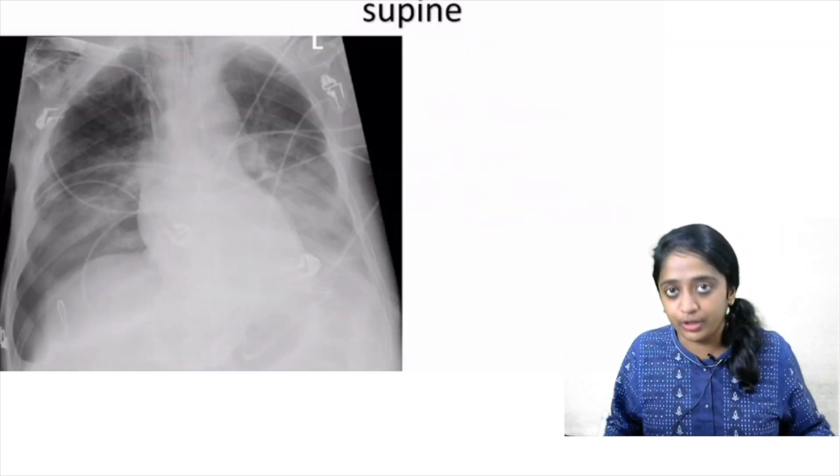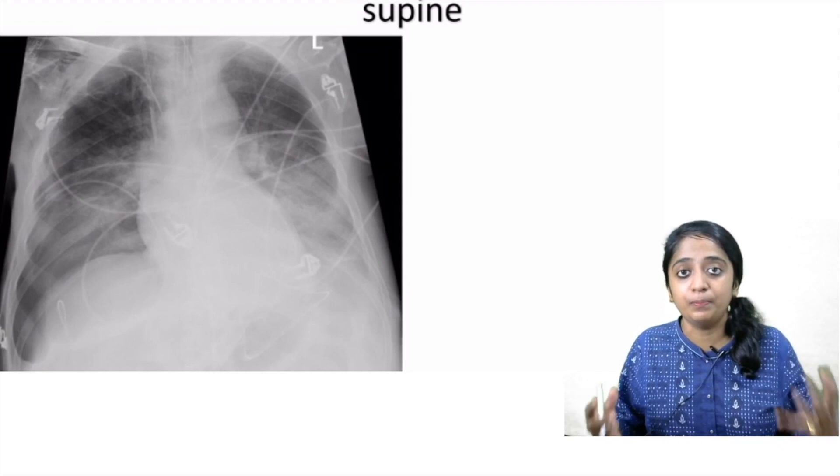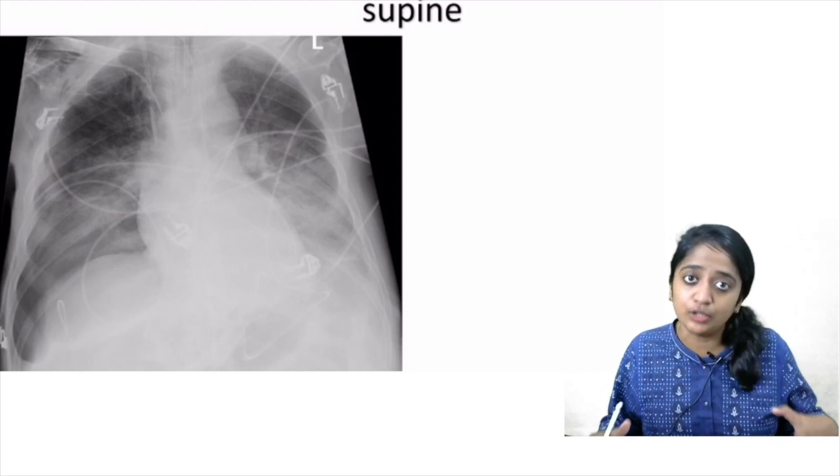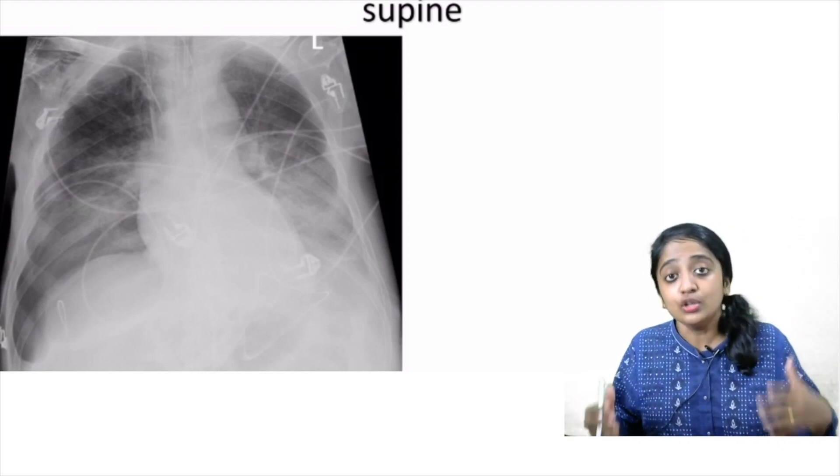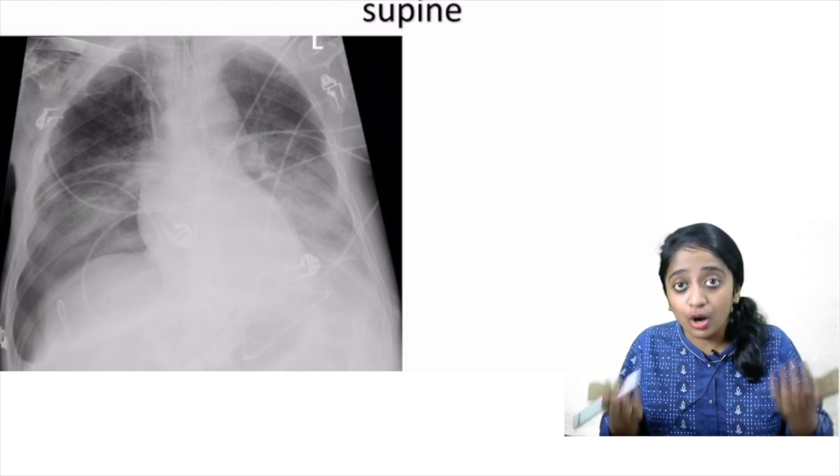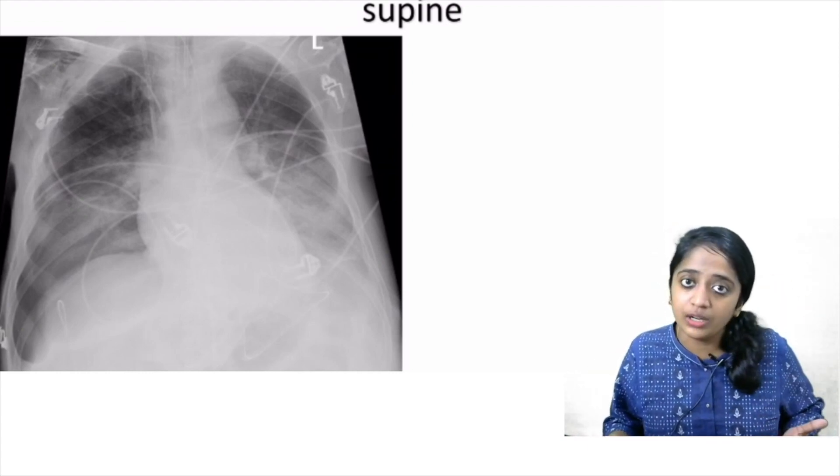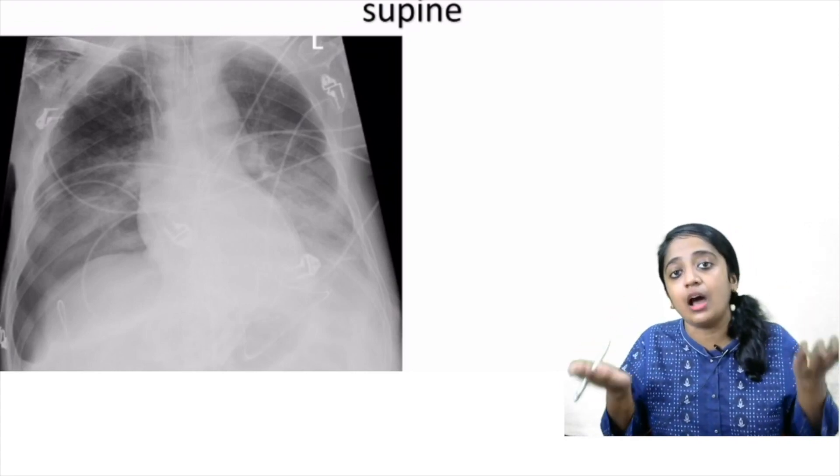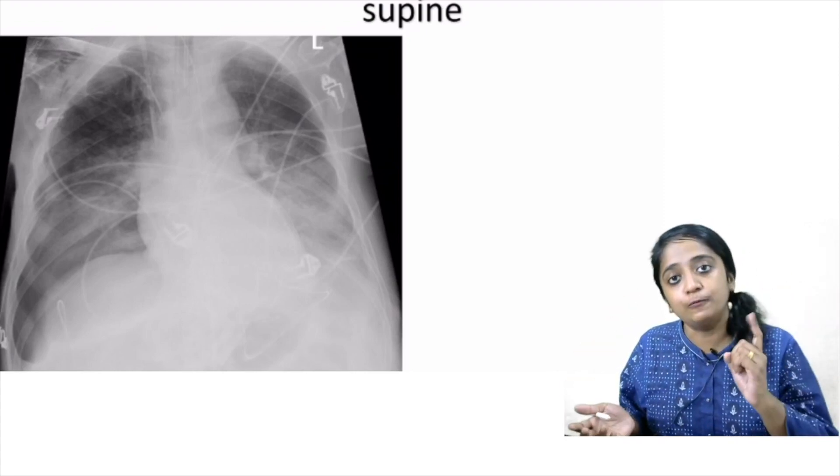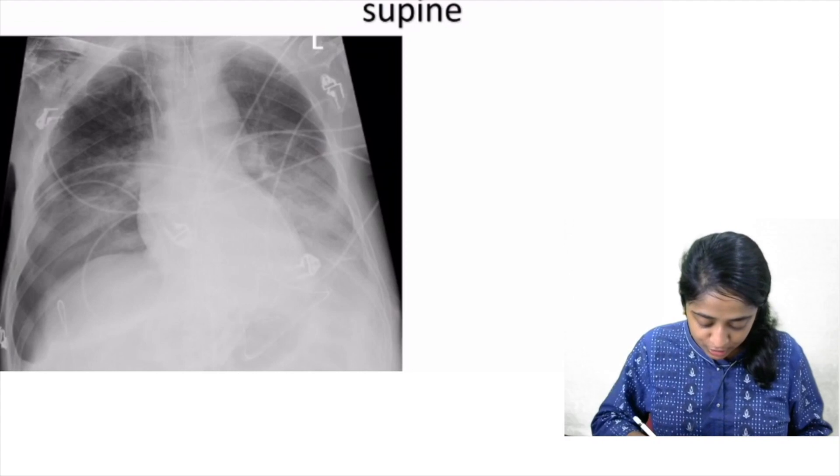Now coming to supine radiograph. As I said in supine radiograph, what is the problem? The patient is too sick to be positioned erect. So supine radiograph, you are going to expect air in the non-dependent position. So where is the non-dependent position? It is an anterior upper aspect. So you have to look for signs. So this is the first feature that you can look for.